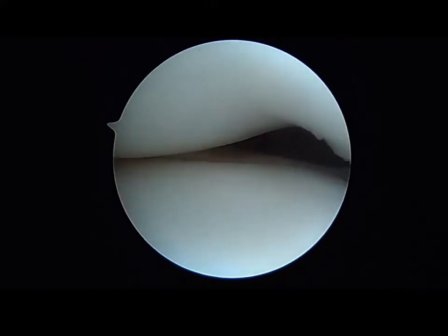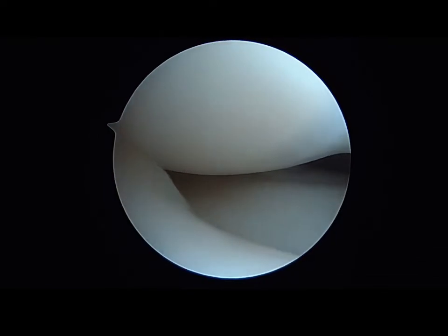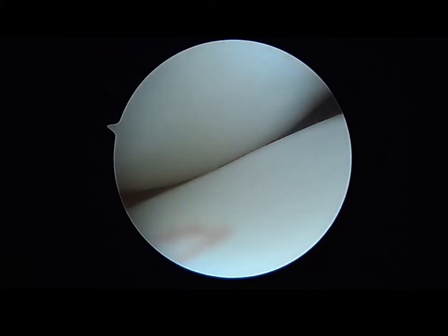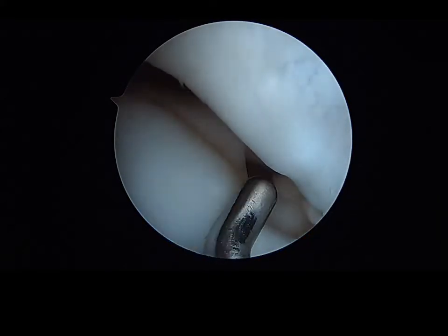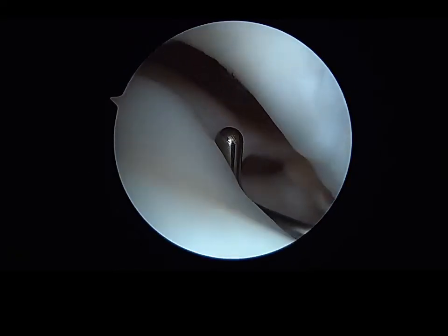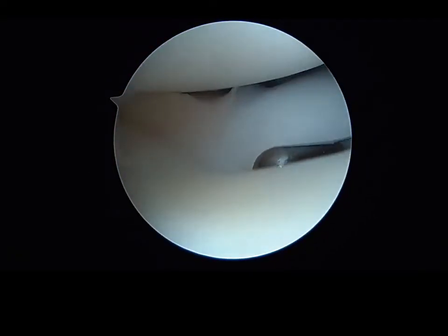From a standard anterolateral arthroscopy portal prior to meniscus saucerization, a panorama of the meniscus is visualized to allow for meniscal width and surface area assessment. A standard 5 mm arthroscopy probe is held vertically along the medial edge of the meniscus to allow for assessment of height and thickness.